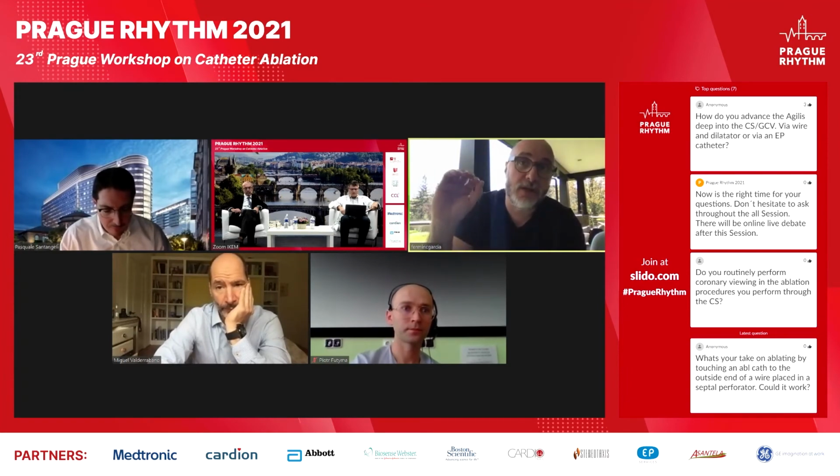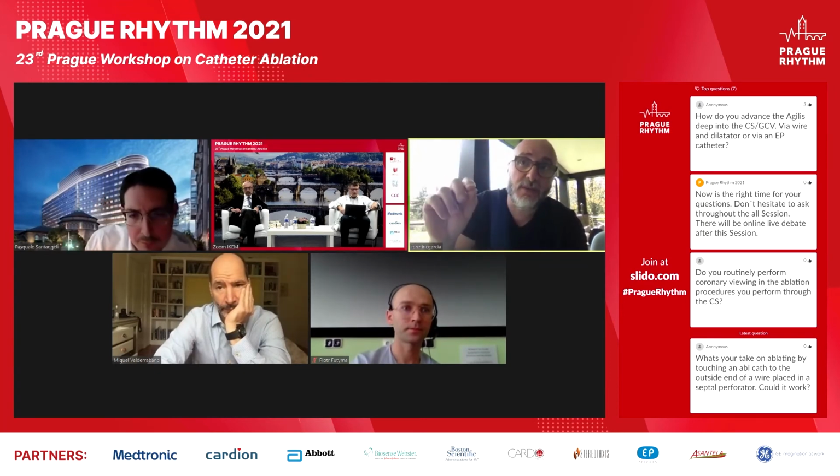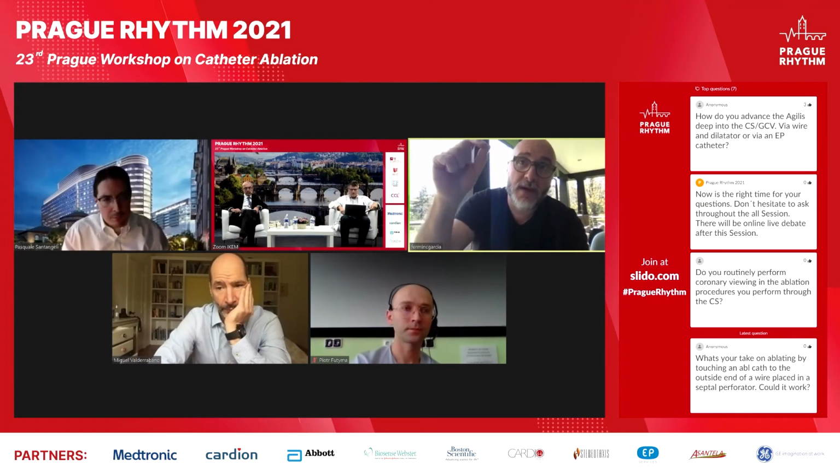I don't skip steps. I always do the same. My first step is to put a coronary sinus catheter. I map the epicardium in the AIV and the great cardiac vein. Then I put it in the intramural space, and then I map RVOT, and then I map LVOT, and I obtain the information, and you know right away. If you're early 45 milliseconds in the AIV, this is subepicardial, and you should now finish your mapping, but you know already what you're dealing with.